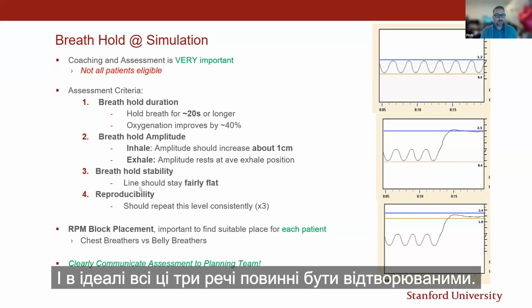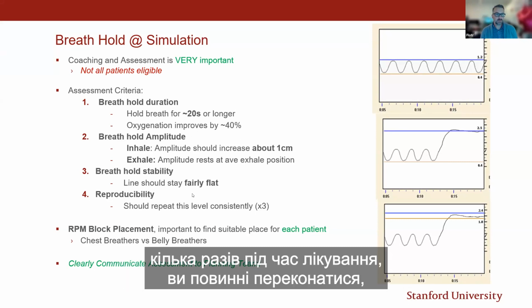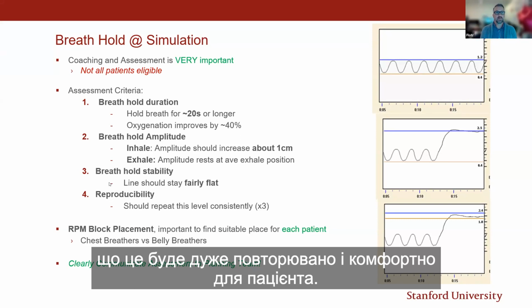And then ideally, all these three things should be reproducible. So because the patient's going to have to do this several times during treatment, you want to make sure that this is very repetitive and comfortable for the patient.